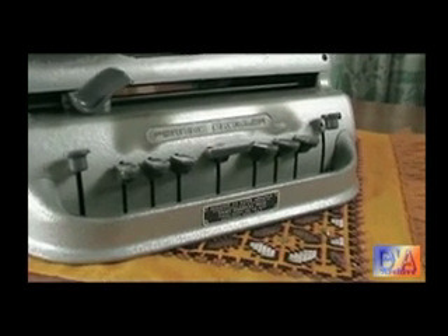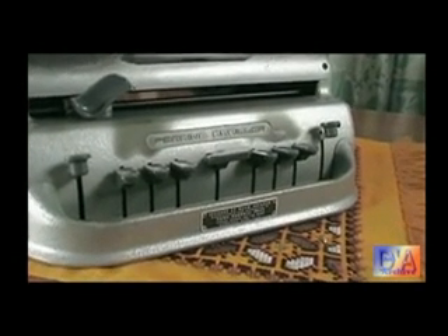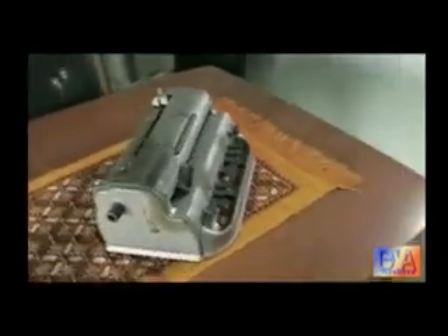Today is Tuesday the 3rd of September 2013, and John Davenport, another member of B-SOL, has come over to give a quick demonstration of braille machines — a couple here that he's expert at repairing. That's correct, yes.